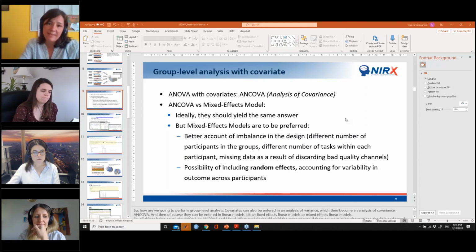Yes, there is definitely an effect of age even within this group, even if the group is already formed. So I would definitely recommend taking this into account and checking the fit of the model. I would anticipate that it makes sense, and that the fit improves.